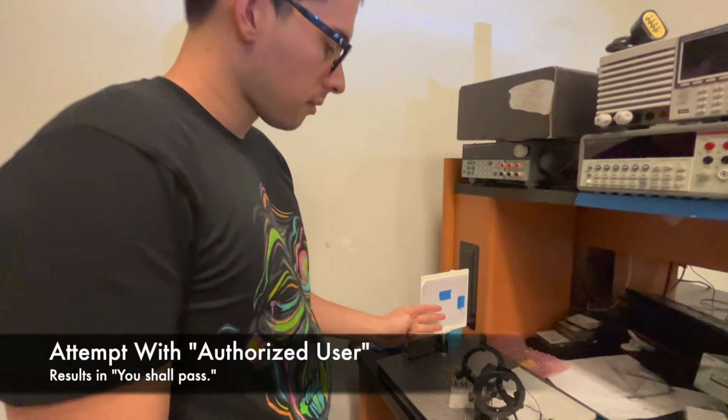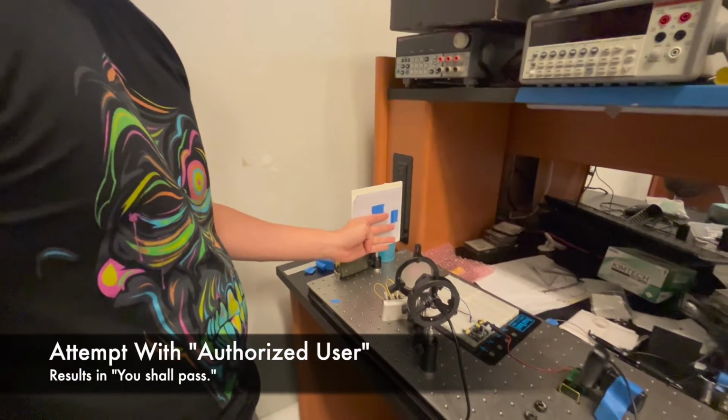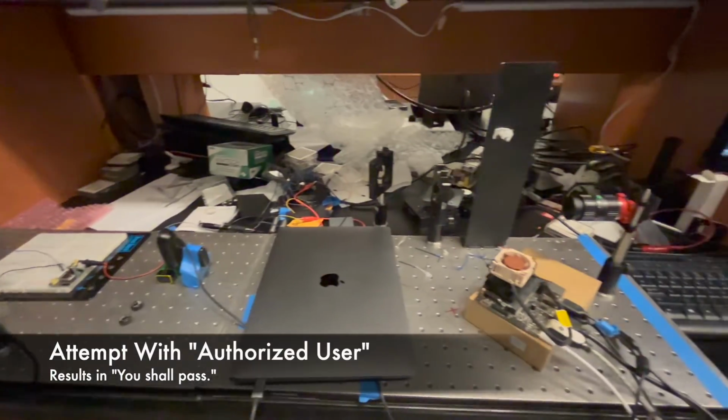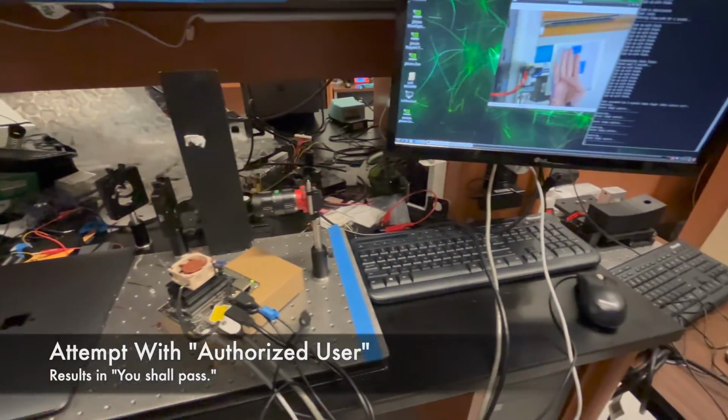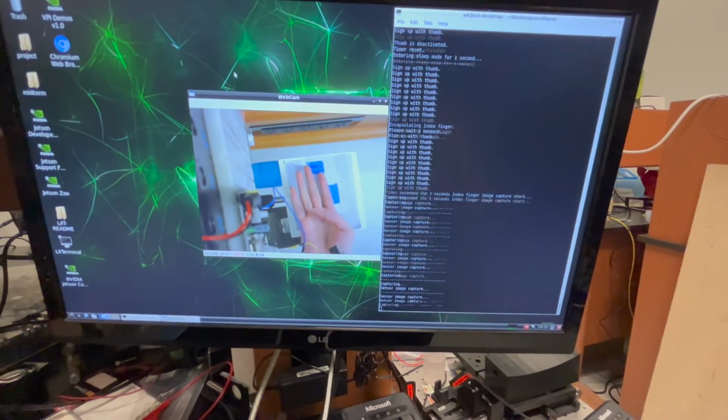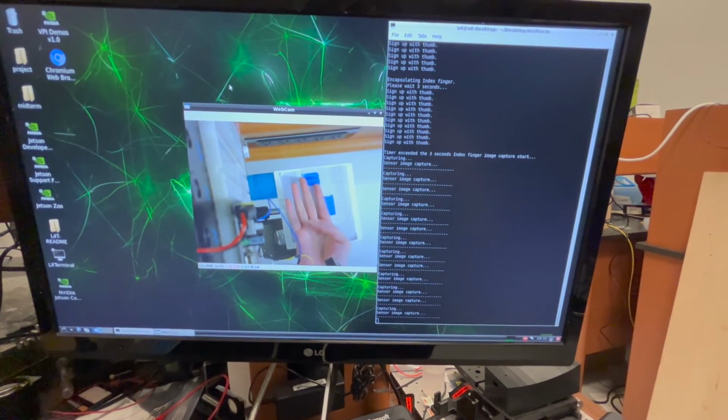So here we show a proof of concept working. I put my finger up to some barriers to have proper placement for the camera. As soon as I put my thumb out, it'll start capturing images through the infrared sensor.